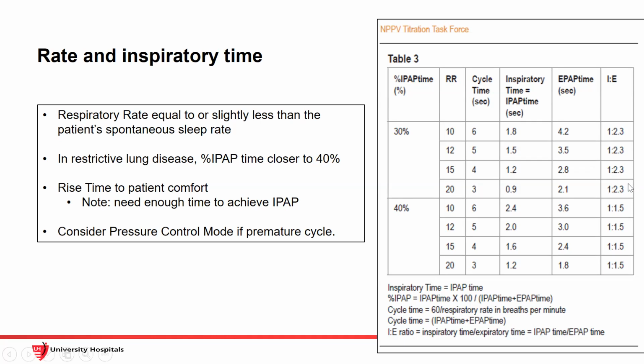Moshe presented this table earlier, which is going to vary depending on your respiratory rate. But under normal breathing conditions, expiration is going to be longer than inspiration. So when you're trying to figure out what's up versus down, the shorter should be inspiration and the longer should be expiration. That's one other tip to use when you're trying to figure that out.